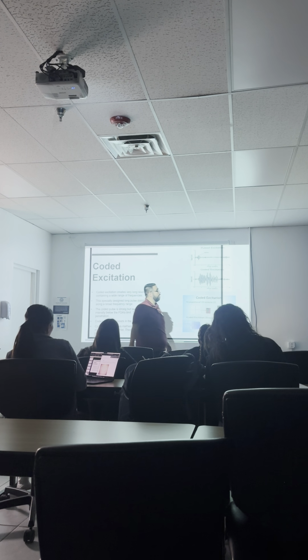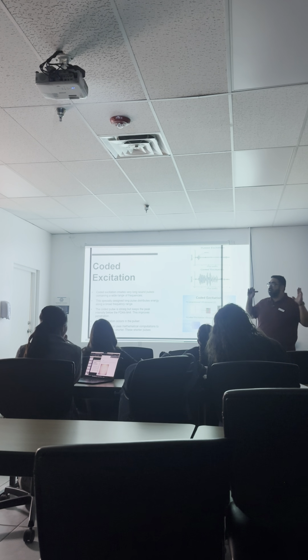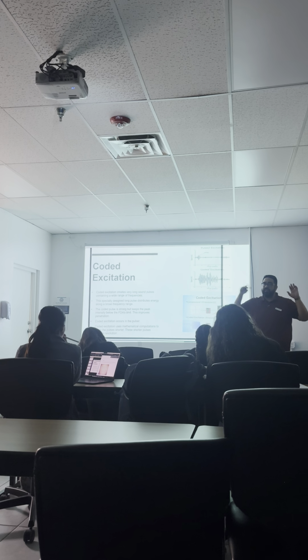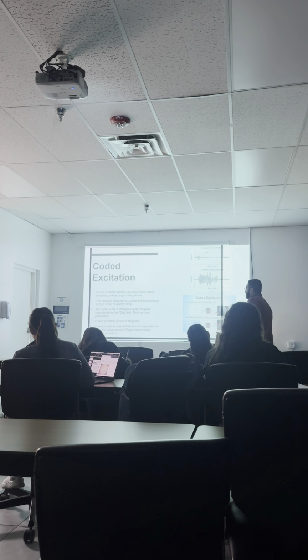With longer pulses. Okay, so it sends out a longer, more intense pulse, right? Which penetrates more, and then upon reception, it uses dynamic equations to pick up the frequencies that it wants to use to make the image. Okay? Coded excitation.